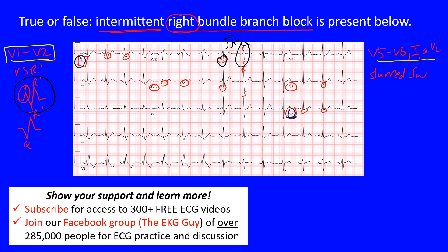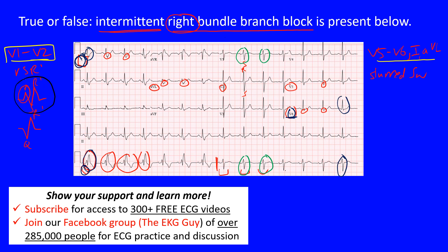Early on in the ECG, in V1, we have RSR prime complexes showing up, and then all of a sudden we see a change to normal complexes. That's why in the V1 lead above we see those initial RSR prime complexes, and in Lead 1 you also see slurred S waves in the early portion but not later, because those later complexes are normal. Looking at AVL, the slurred S waves are present, and below in the rhythm strip we still see those RSR prime complexes - that is right bundle branch block. It's intermittent because it doesn't last throughout.